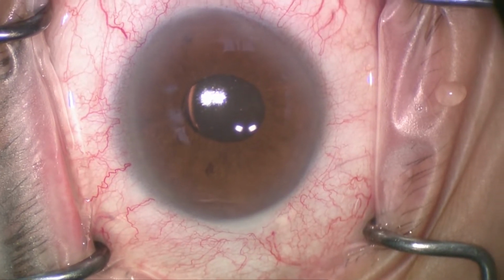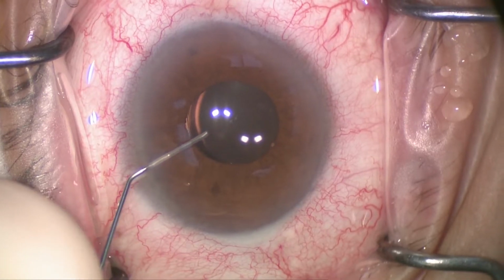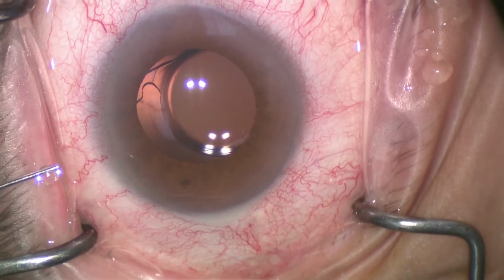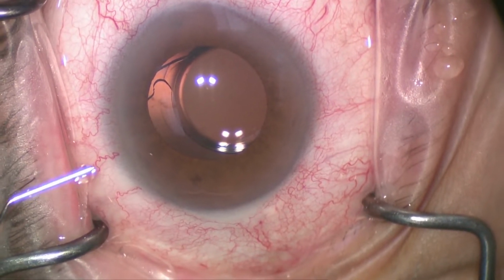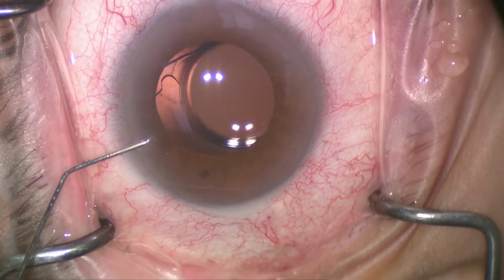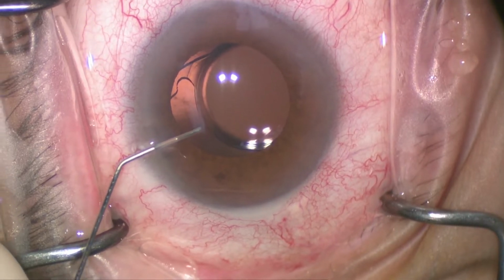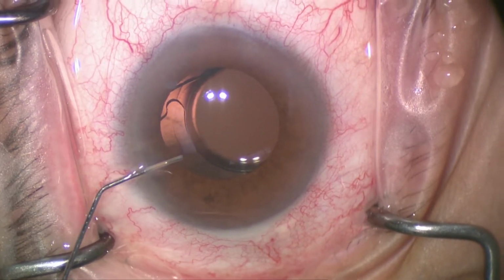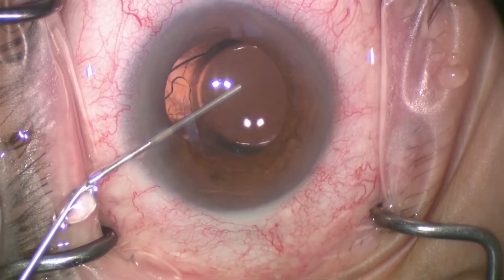The case is a 60-year-old man who presented 8 years after uneventful cataract surgery with complaints of a line through his vision. In clinic, the lens was noted to be inferiorly subluxated but seemed to be loose in the capsular bag. In the OR, with the pupil widely dilated, you can see here that the lens is not well centered, but the haptics appear to be intact. The capsular bag is also devoid of scar tissue and appears completely clear.